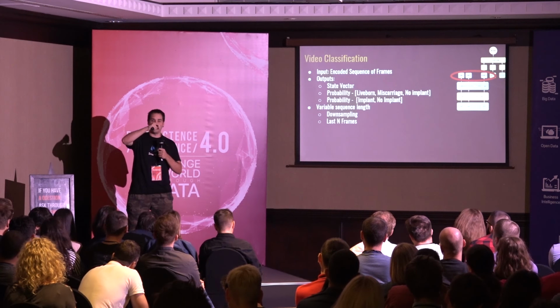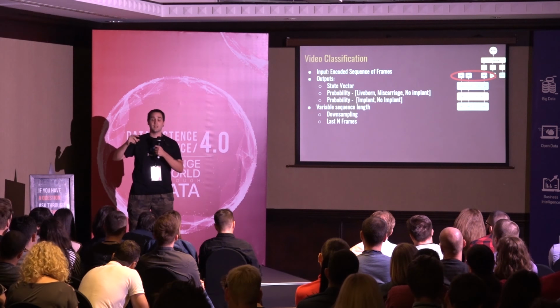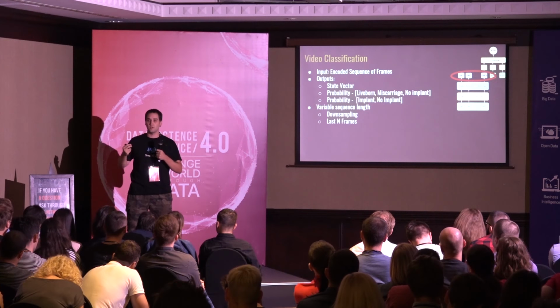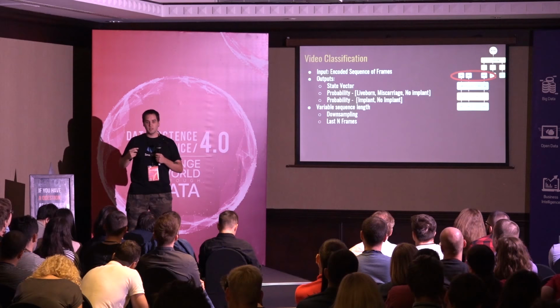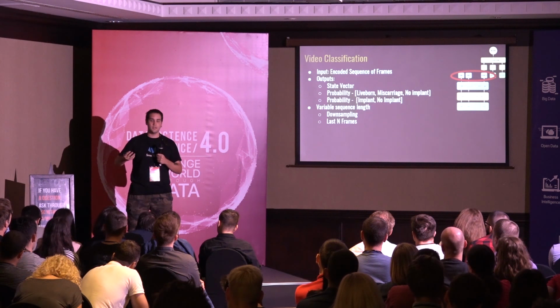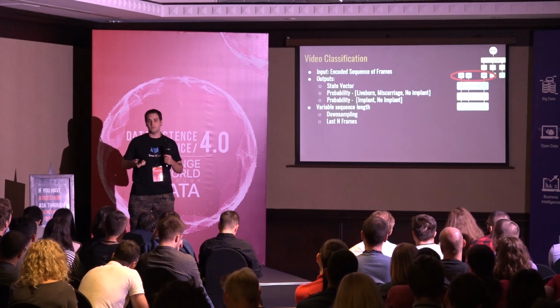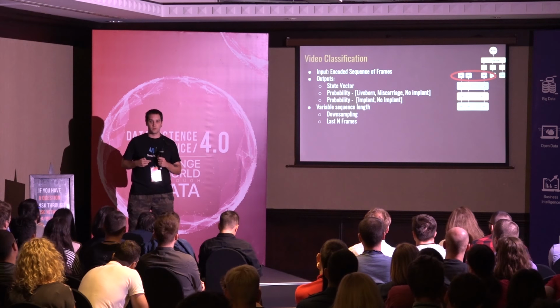Then we sample one frame from each group, and that way we make another video with 100 frames. This is also a technique where we can sample as many times as we want, so it is some kind of data augmentation as well. And it proves to work okay.